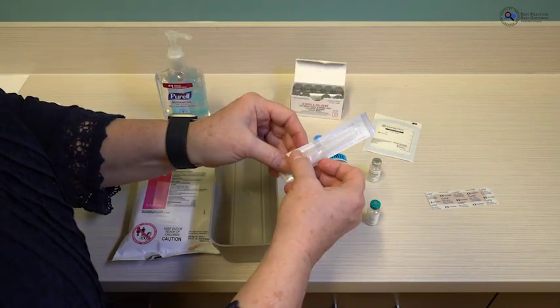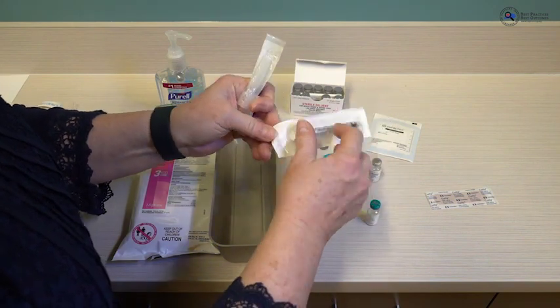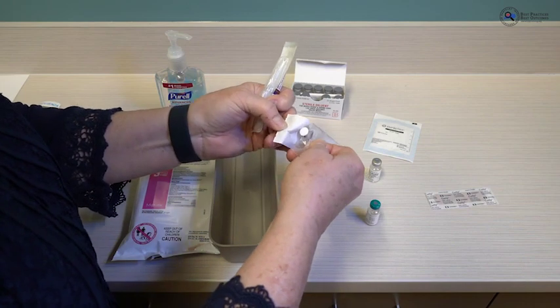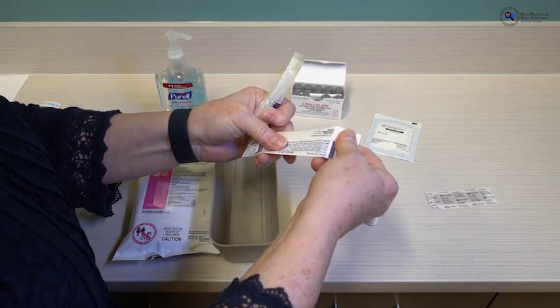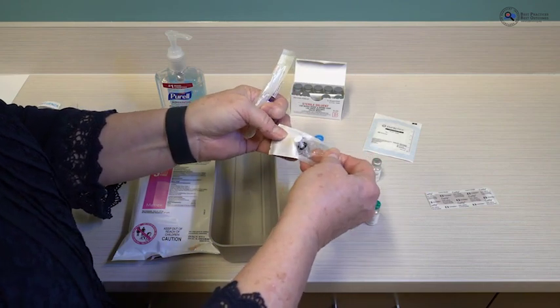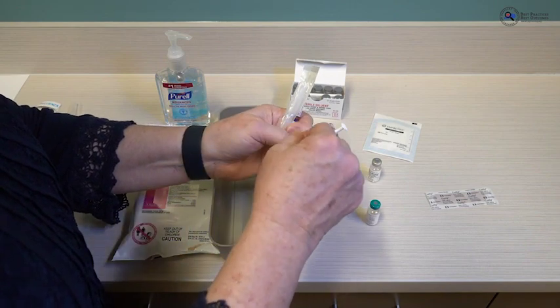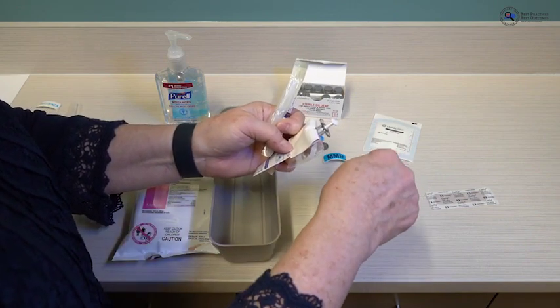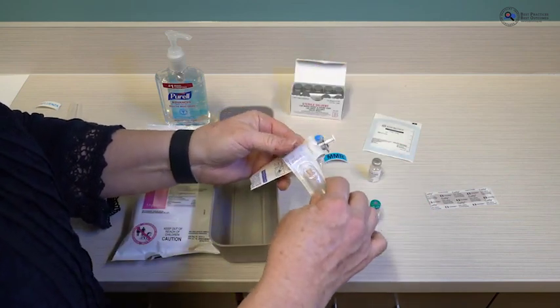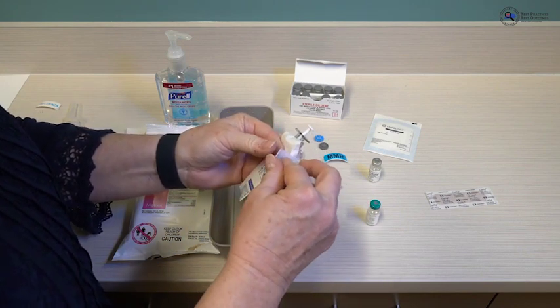During that drying time, go ahead and prepare your syringe. You will have a sterile needle and a sterile syringe. Open them both the way they were designed to be opened — you peel them. Never punch them through, as that can contaminate the sterile item. Remember, your vaccine and diluent will not have a preservative, so anything you contaminate will ultimately contaminate the vaccine, and that is what you will administer to the patient. Infection control is very important.